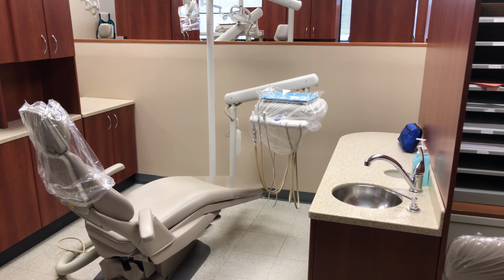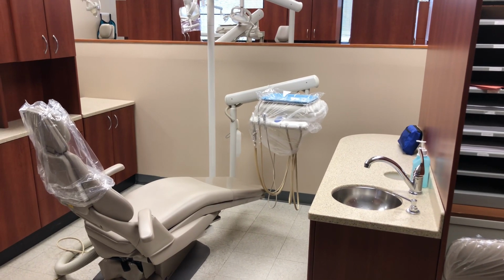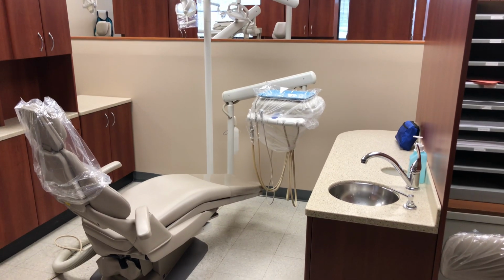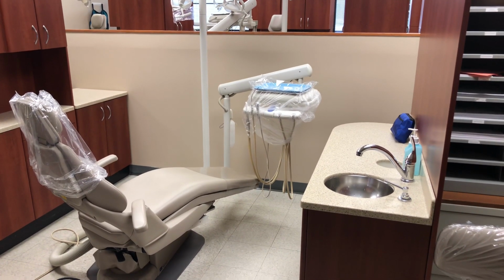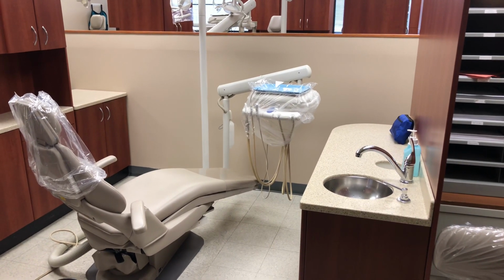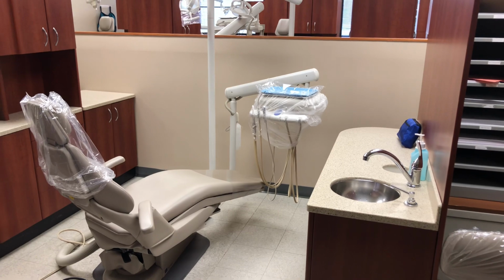This is part 1 of the extra and intraoral examination. This will be focusing on the extraoral. You will refer to your clinic manual pages for the exact written protocol. Some items may be done slightly different in the video.